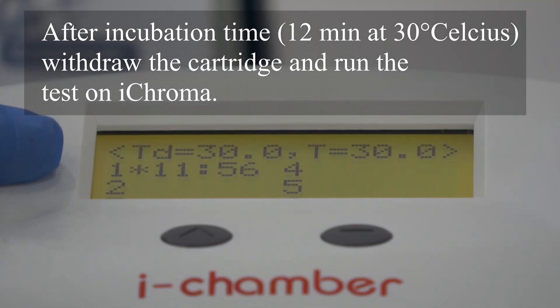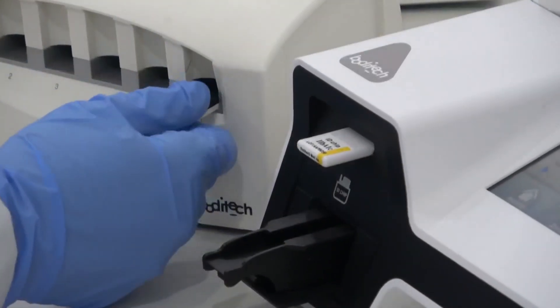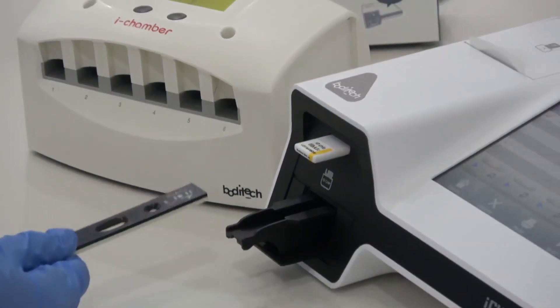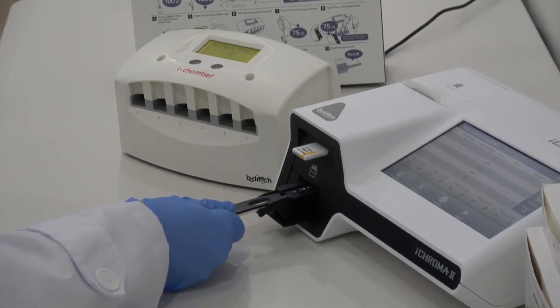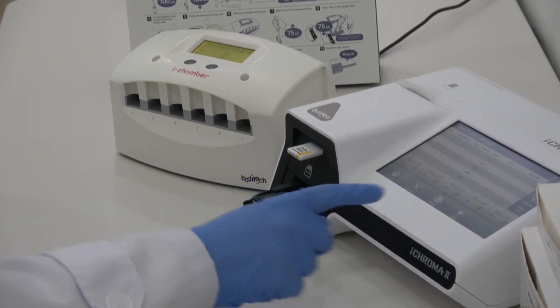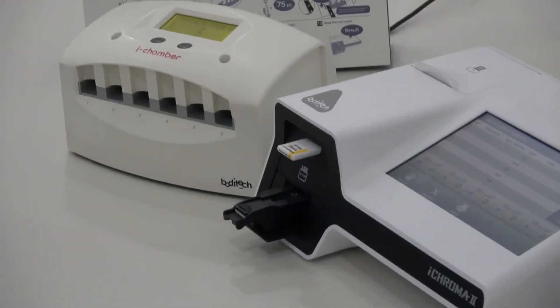After incubation time, withdraw the cartridge and run the test on ICHROMA.